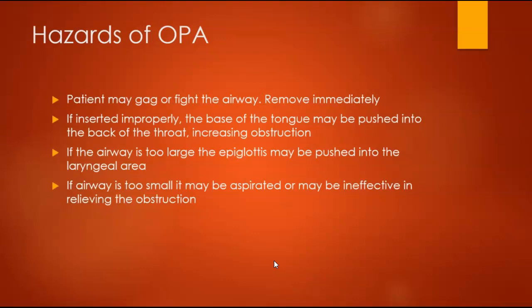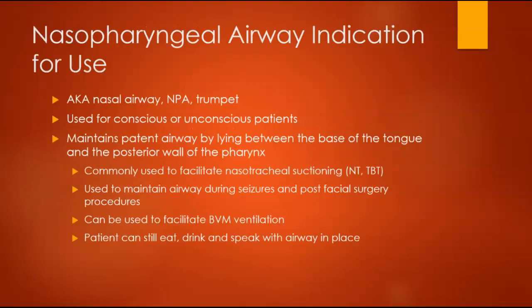Meaning the oral airway that you're inserting, if it's too long, that might interfere with the epiglottis, and it may push it into the laryngeal airway and cause an obstruction. If it's too small, it may be aspirated, and it may be ineffective or lead to obstructions as well.